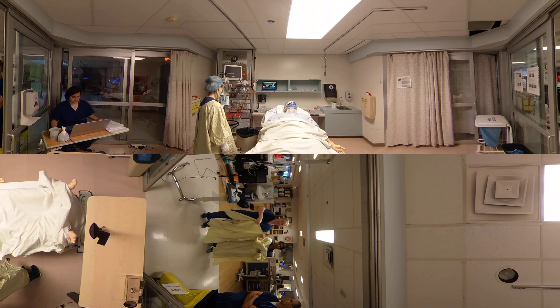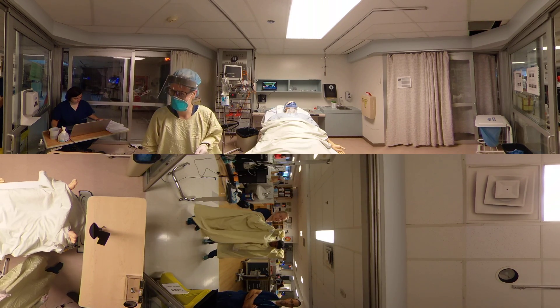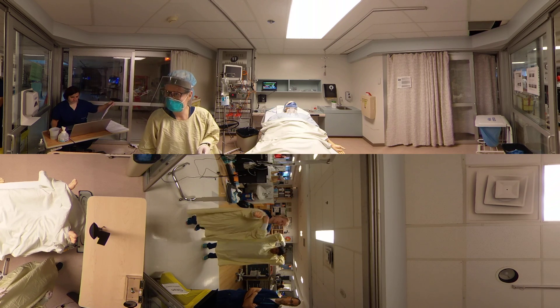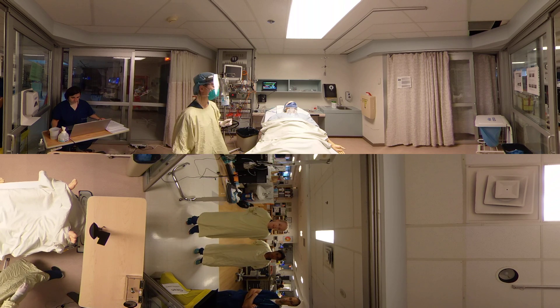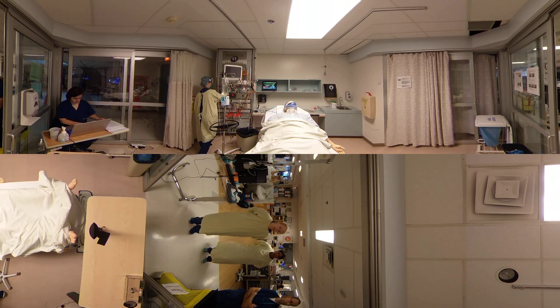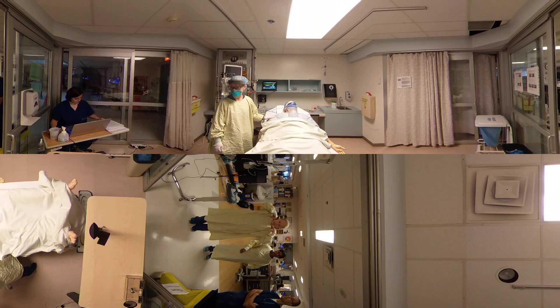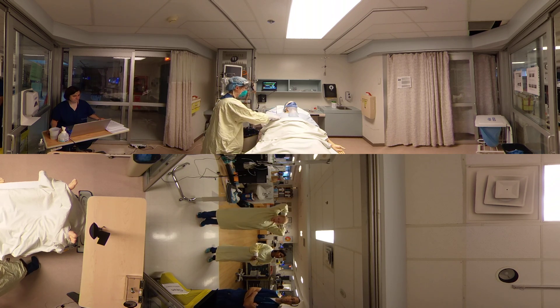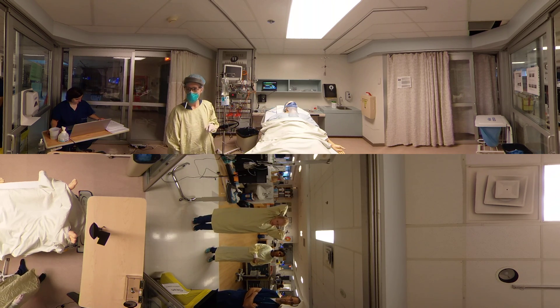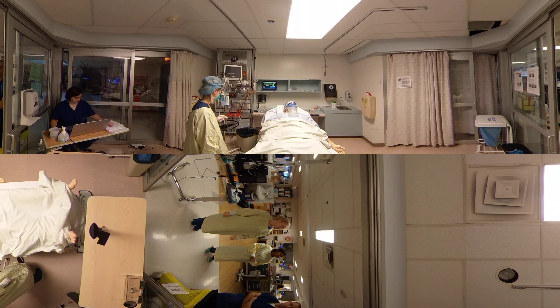Is the patient really desaturating in there? Yeah. Stephanie, I noticed the patient is desaturating. How much oxygen flow is she on? Can you turn it up as high as it will go, please? Can we cycle the blood pressure cuff as well? Is she awake? Yes. I see her breathing. Alright, let us know if she continues to deteriorate, please. We're coming in as fast as we can. Opening into the back, securing ties with neck and waist — you've done that.